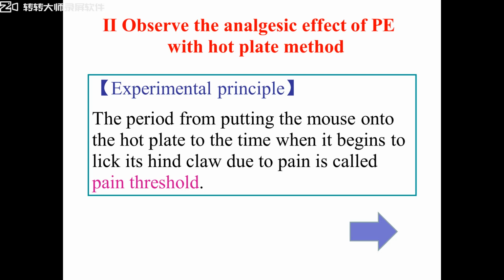The period from putting the mouse onto the hot plate to the time when it begins to lick its hind claw due to pain, we call this the pain threshold. Okay, so let's watch the video and you can know the details. What's the meaning of pain threshold?